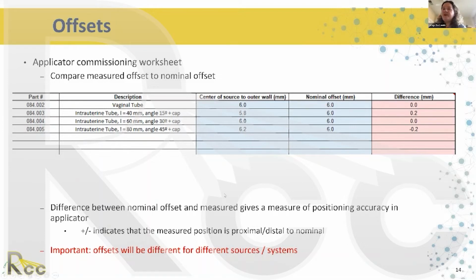If I see near a millimeter offset between what I measure and what the manufacturer gives me, I talk to the manufacturer, because that is higher than I would expect from current manufacturer accuracy. 0.2 or 0.3 millimeters is pretty normal to find. Above 0.5, I'm starting to get concerned and will probably repeat my measurement. If it's reaching near 1 millimeter, I talk to the manufacturer to see if there's an issue.